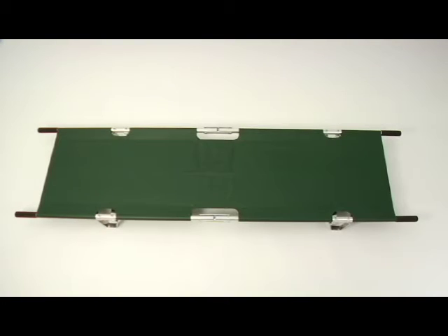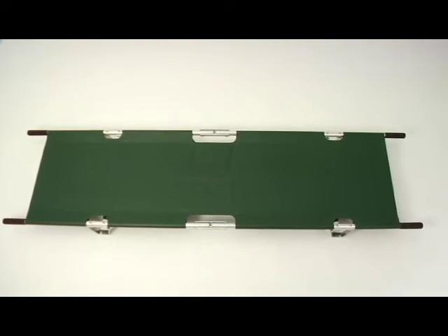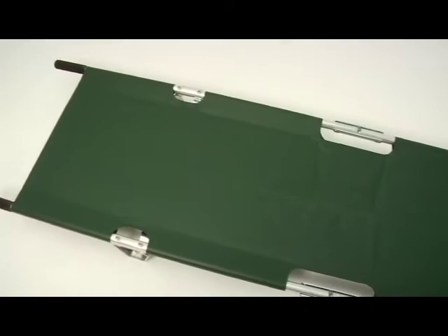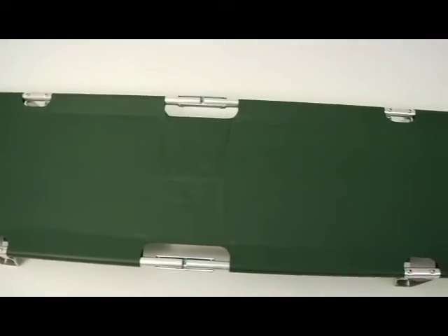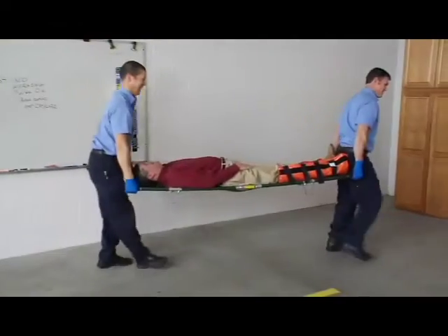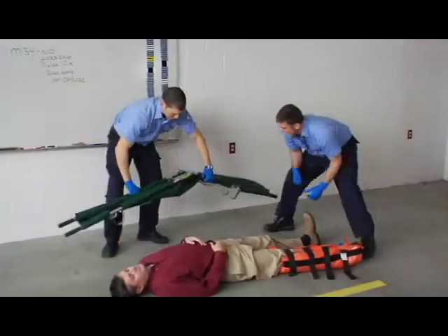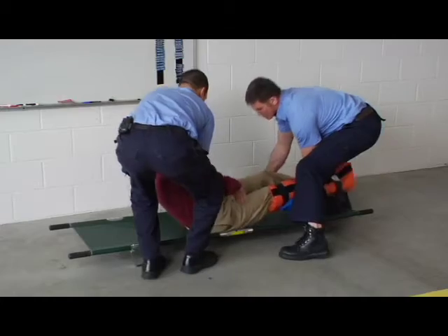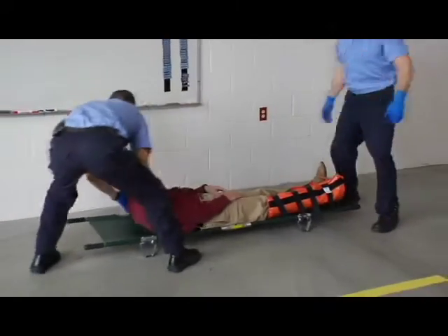The FERNO Model 108 pole stretcher is designed to transport a patient from the rescue site to an emergency vehicle. It features heavy duty aluminum poles with hand grips and a vinyl coated nylon cover. To use the stretcher with a patient, unroll the stretcher next to the patient and transfer the patient onto the bed of the stretcher using EMS approved procedures.